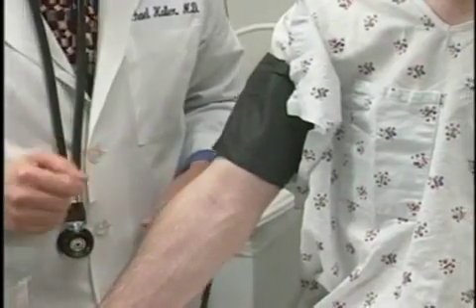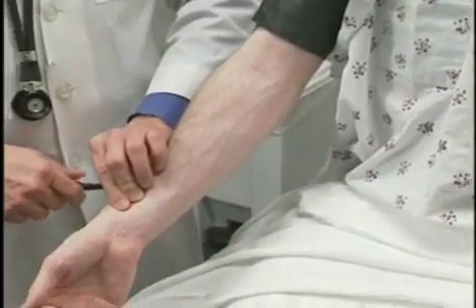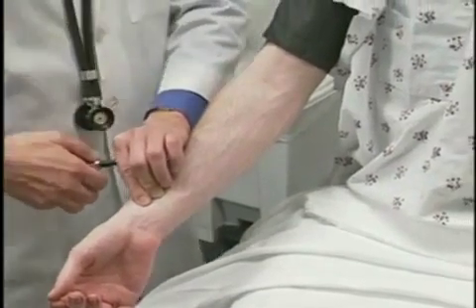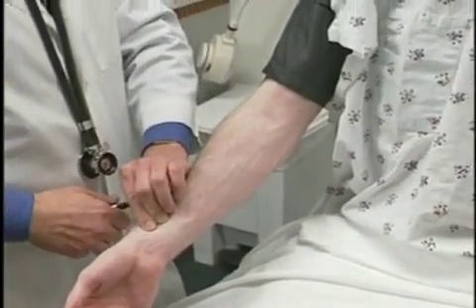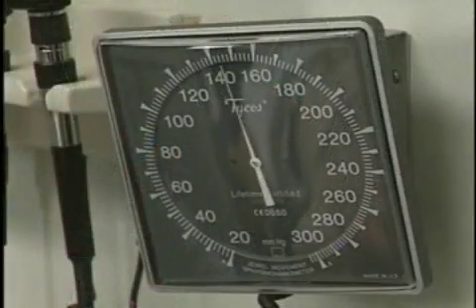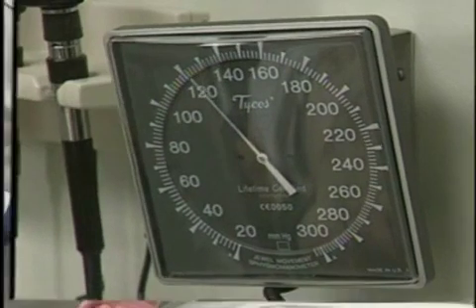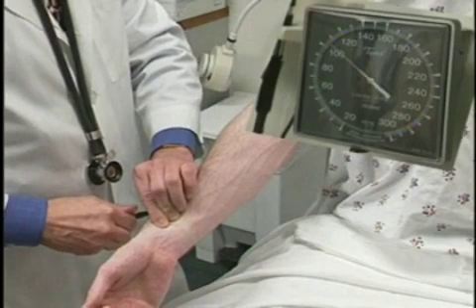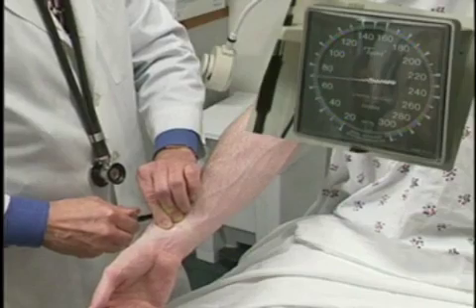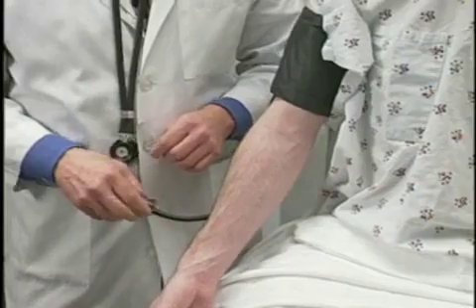First, we're going to check the blood pressure by palpation. Simply identify the radial pulse, tighten up the valve in the blood pressure cuff, and by watching the sphygmomanometer, I'm going to determine when I stop feeling the radial pulse and blow up the cuff approximately 20 beyond that. And I felt the pulse disappear at about 110. As I released the air from the cuff, I felt it return at about 110. This tells me that the systolic blood pressure is approximately 110.